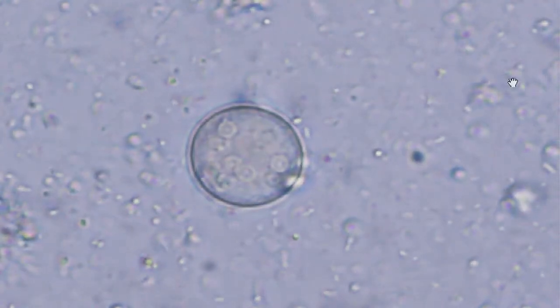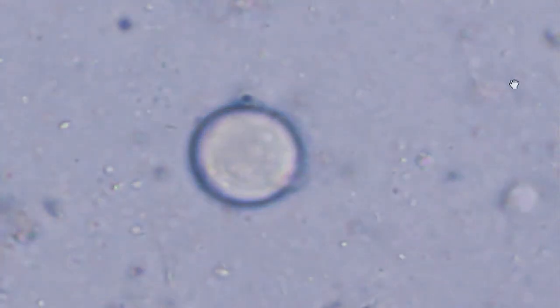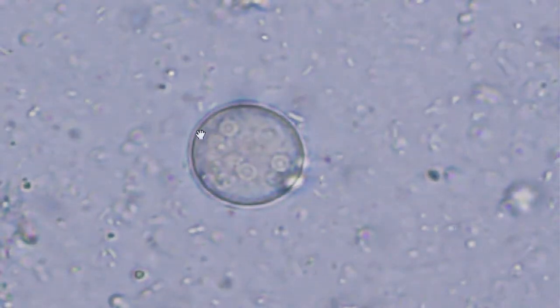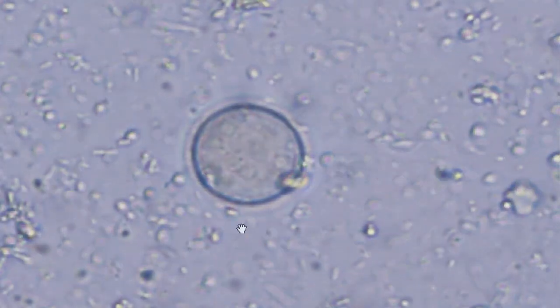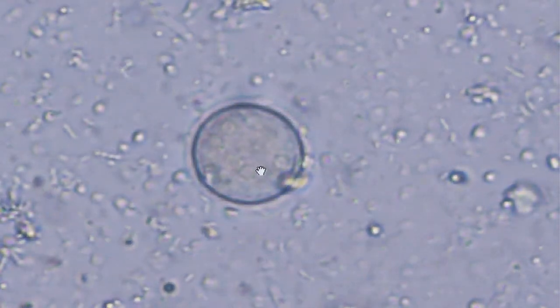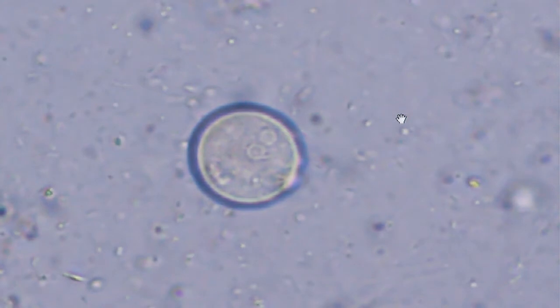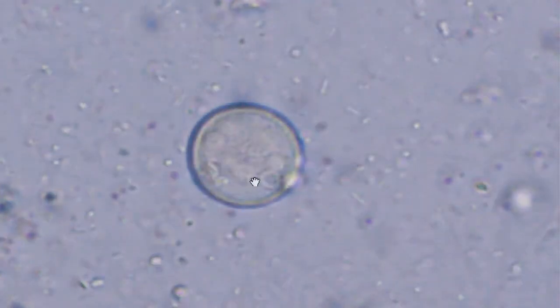And here's the cyst. What I first do with these in a wet prep is go through the planes of focus and count the nuclei. So here we have 1, 2, 3, 4, 5, 6, 7, 8, 9, 10 nuclei possibly. That doesn't make sense. It should be 8 to 16. So this may even be a supernucleate cyst with 16. But there's at least 8 nuclei in there, which means it has to be Entamoeba coli. It cannot be any other species if it's got more than 4 nuclei in the cyst.